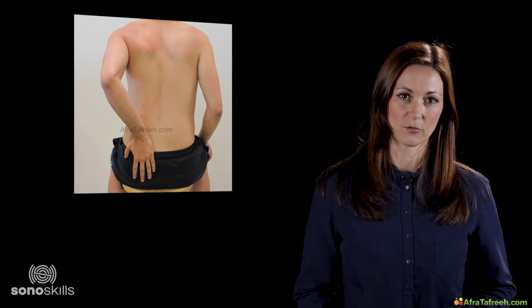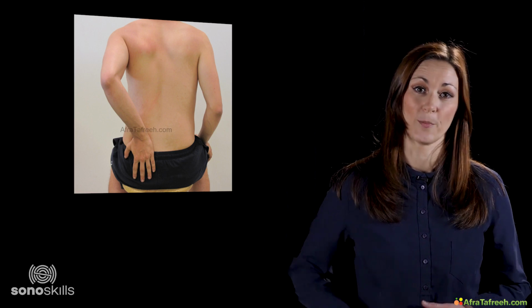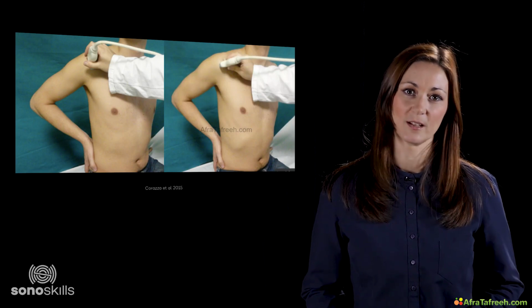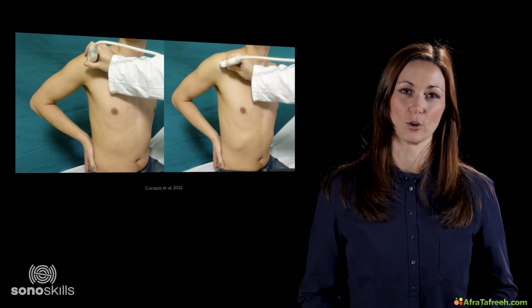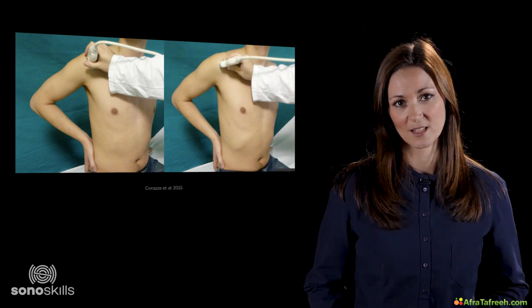If the patient sits in the modified CRASS position, the shoulder is in extension and slight internal rotation because of the hand placement on the iliac crest or the back pocket. Important to note is that the patient's elbow should point posteriorly. This modified CRASS position leads to less internal rotation of the shoulder and therefore also a diagonal fibre orientation of the supraspinatus.